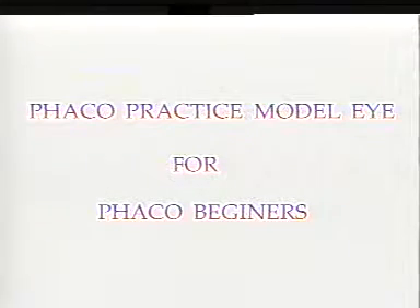For the phaco learners, we have developed a simple, affordable practice eye. This practice eye can be used by beginners for getting conversant with the various foot switch positions and manipulations of the phaco handpiece.